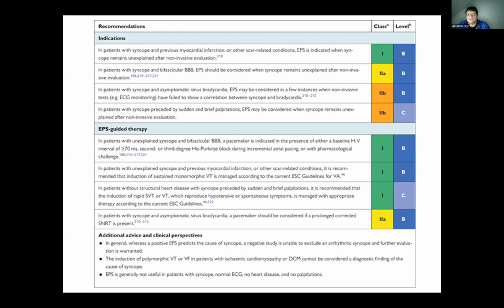So what we're interested in is basically things like loss of patient color, seizure activity, especially if you get the onset of the episodes. We're starting to see a few more recordings as we've asked people, certainly people who have recurrent syncope, to ask relatives to record. There is quite a lot to be gained from it, I think, especially if you can catch the onset of an episode. Frequently we only get the middle and end of it, which is not as helpful. And patients who have long asystolic events can have seizure activity which is a result of hypoxia rather than an actual seizure. So it's useful to see if it's starting with a seizure or whether this is a sudden drop attack.